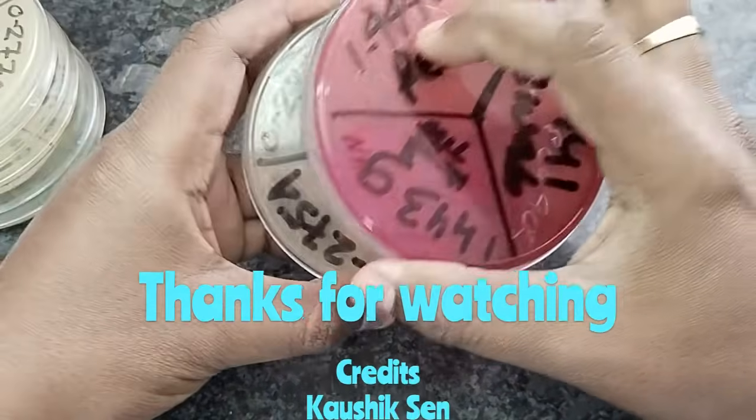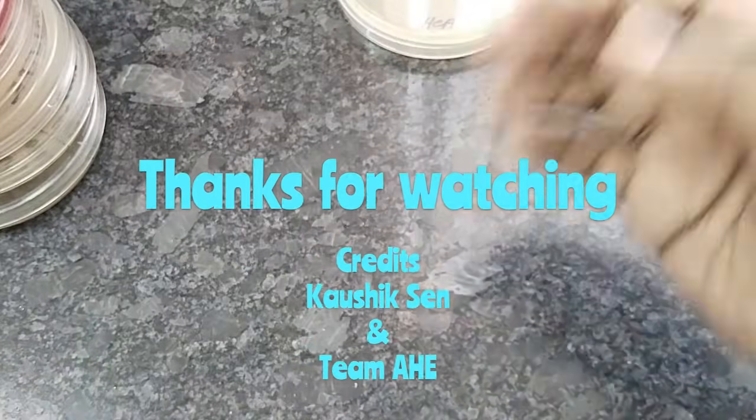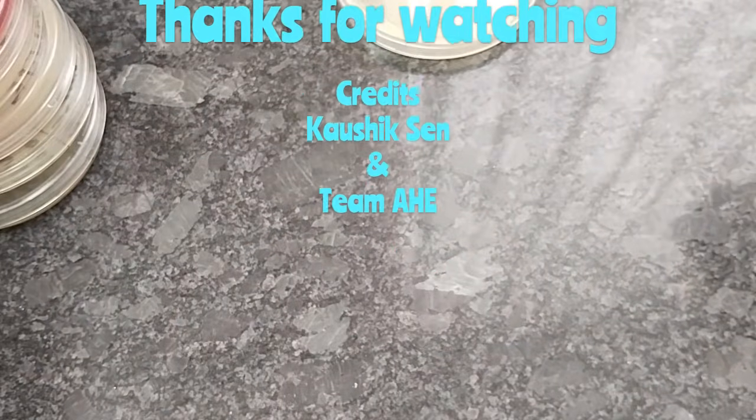So in this lecture, we can understand the HiChrome Agar, and we can demonstrate how to identify the different types of colonies in HiChrome Agar.